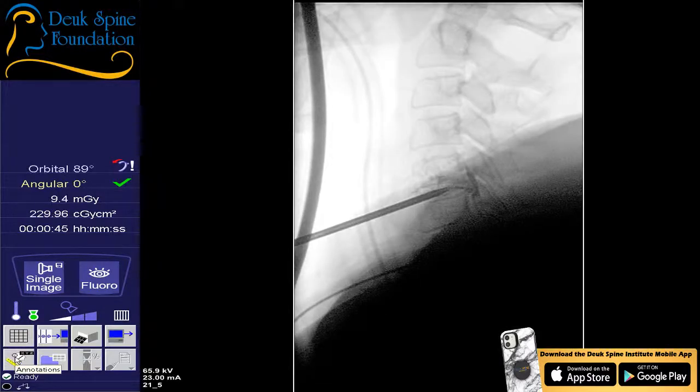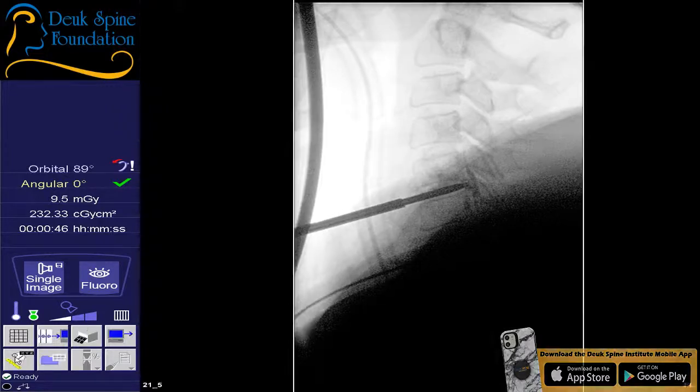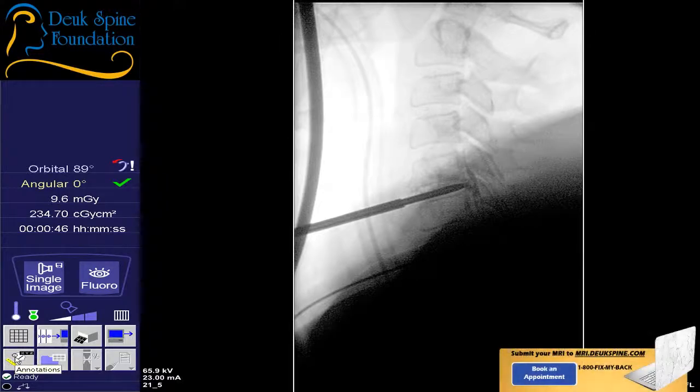All right, I just need to get it back in the disc. All right, let's get the tube over it. So you all saw me do this last time. We're going to do the same sequence now. The tubular retractor goes over the dilator. I advance it through the soft tissue. Remember, the advancement through the soft tissue is the same now as it was last disc because we haven't made a new hole, have we? We're using the same pathway, the same skin incision, the same path that we used for the first one.